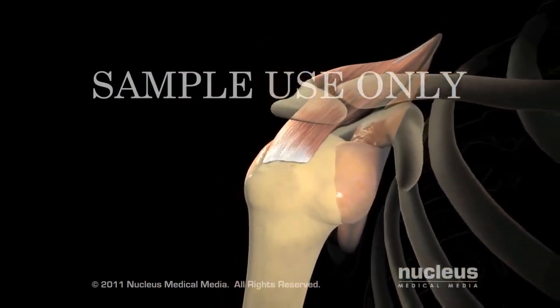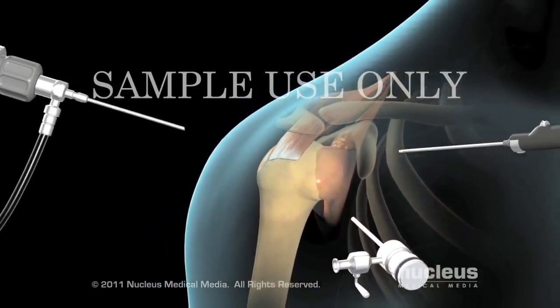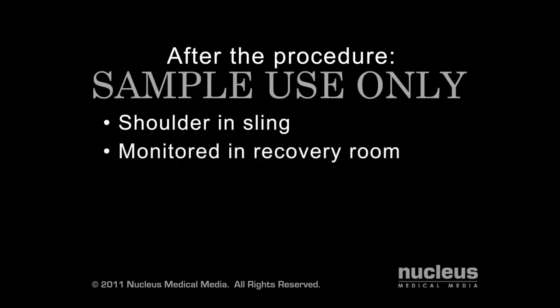At the end of the procedure, your surgeon will take out the arthroscopic tools and close your incisions with stitches. After the procedure, your shoulder will be placed in a sling for support and protection. You'll spend a few hours in the recovery room and will most likely go home the same day.